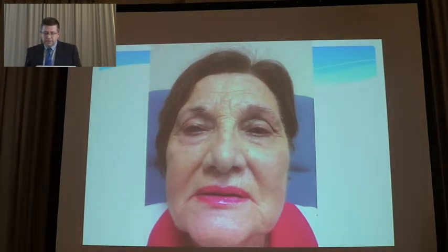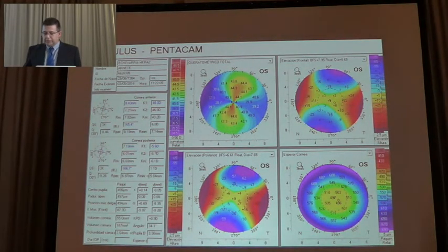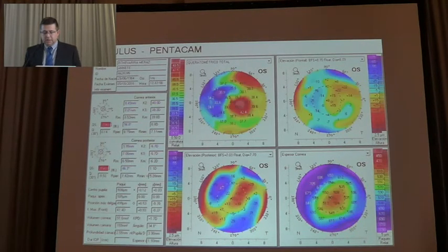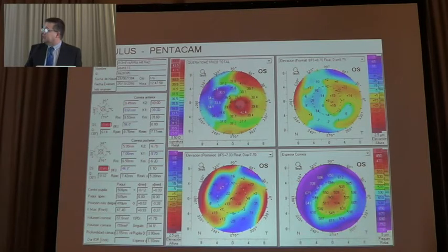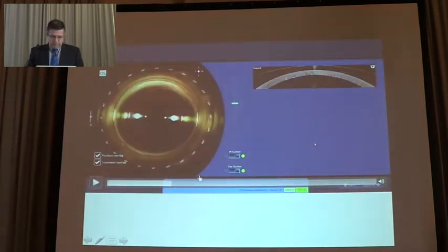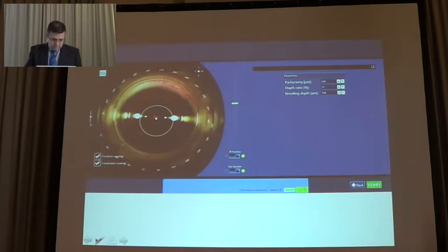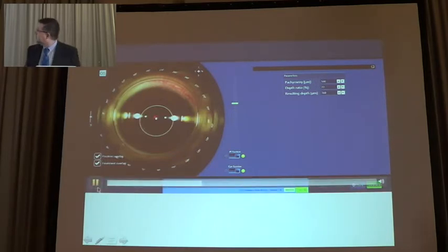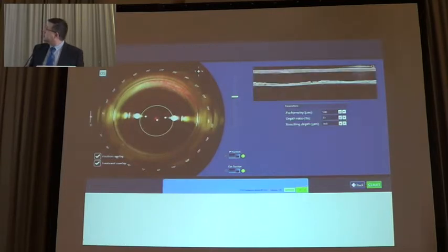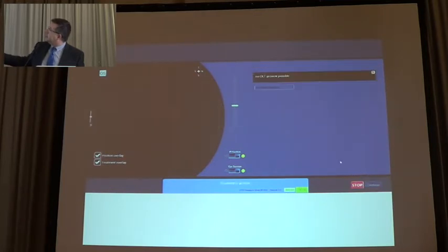We can also use intracorneal rings not just for keratoconus but for some refractive procedures. Here we have minus 7 diopters of astigmatism and a good result with good visual acuity after intracorneal rings. And as you can see here, when we have the intraoperative OCT, we can see exactly where we are creating the tunnel and move it up or down as needed.